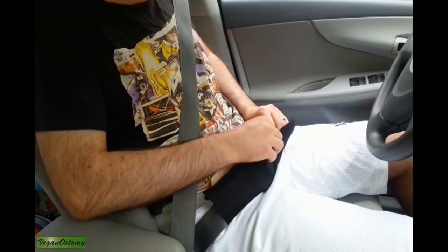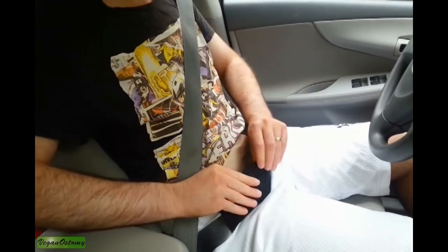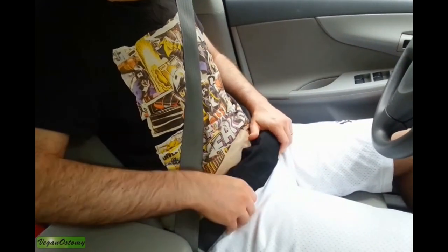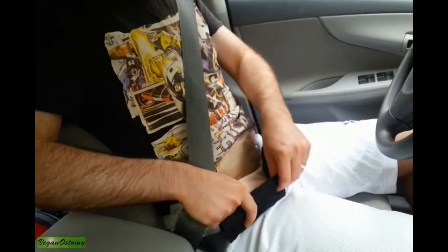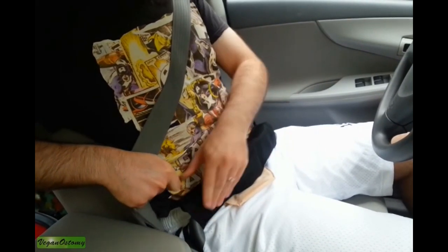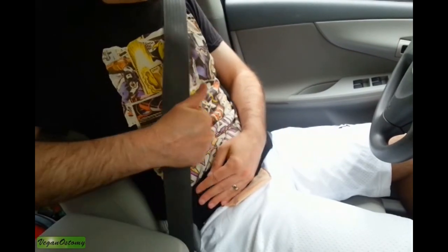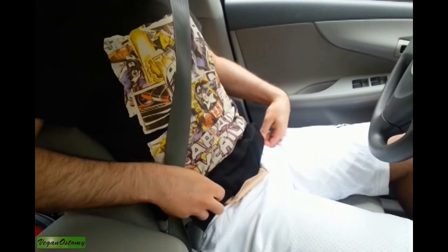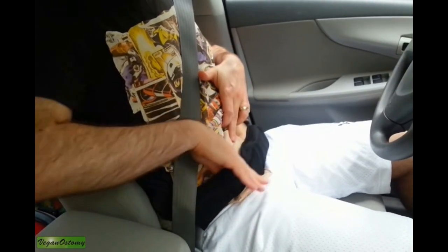It has these velcro attachments that you can use to secure the product, and you can leave this on all the time — you don't have to keep removing it every time you get in the car. Basically, it has this channel that goes right over your stoma, and these side pieces essentially put the pressure on your abdomen but not on your stoma. Once that's on, everything is nice and secure.